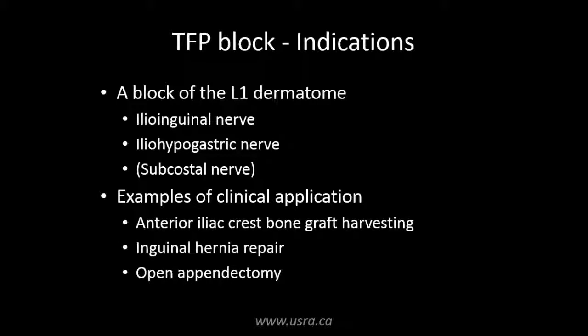It would also be a suitable analgesic option in any surgery involving the L1 dermatome, including inguinal hernia repair and open appendectomy. A question that is often asked is, how does the TFP block differ from the TAP block?